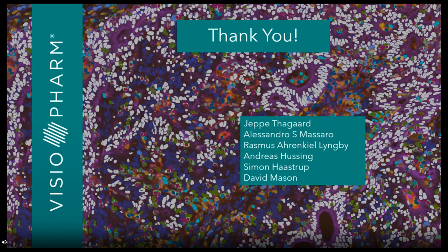Thank you, Dr. Vasaturo. Our next question is, cells in solid tissue are usually close together or close to each other, forming clumps and or overlapping with each other. How does the Visiopharm software deal with that? Yeah, that's a great question. So that's something that the user would then need to train also the deep learning classifier.